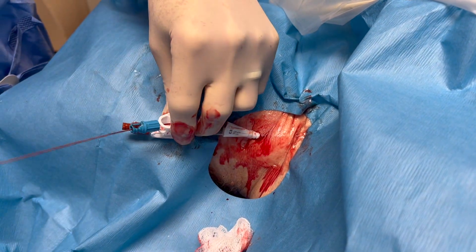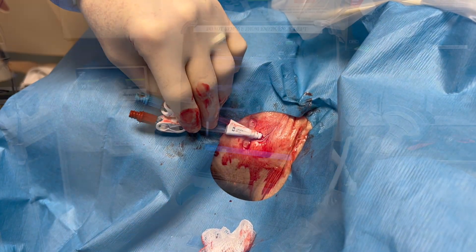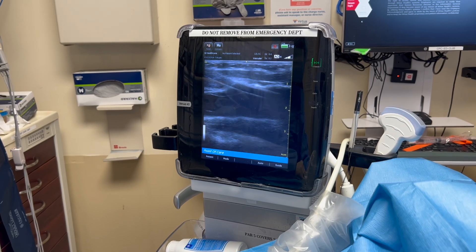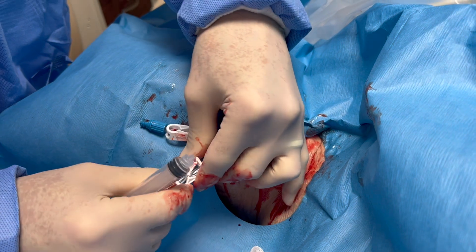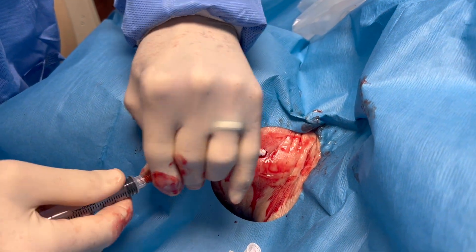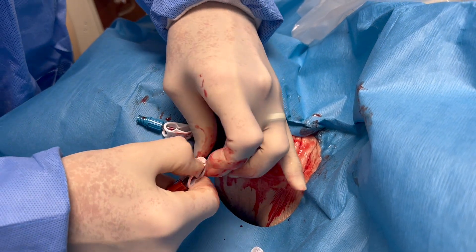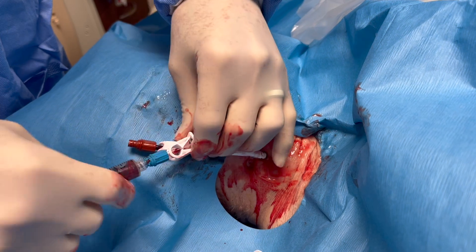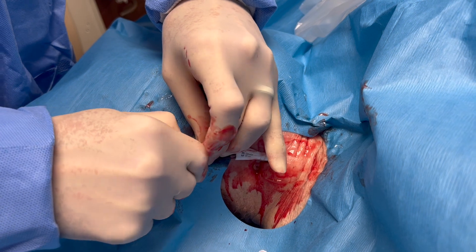As you pull the wire out, you will see blood return, and then you can clamp that port as well — so now both ports are clamped. Take a look with your ultrasound to make sure you are in where you want to be. Now take a syringe and make sure that you get a free return of fluid. The last thing you want is a difficult return, because then the catheter won't work when you hook them up to dialysis. And there you see again — free return of blood.